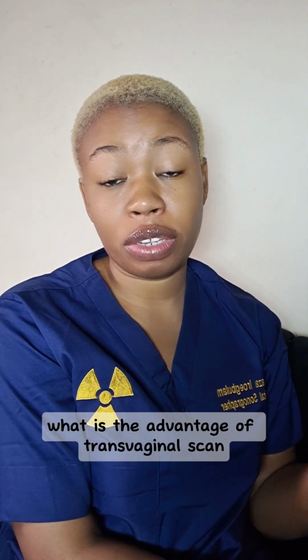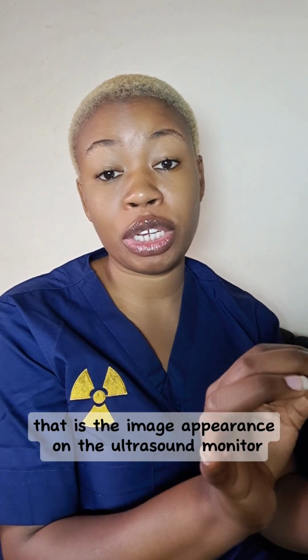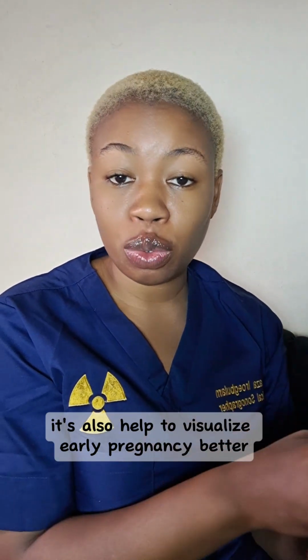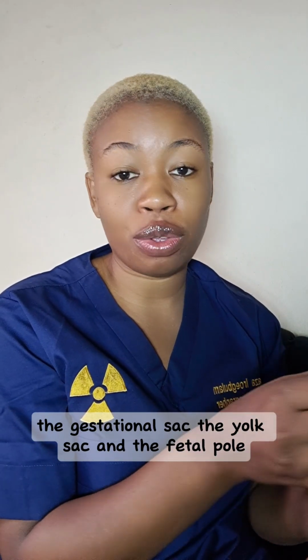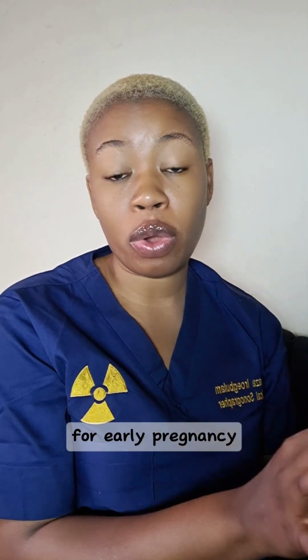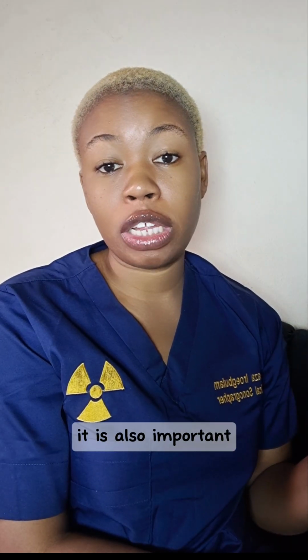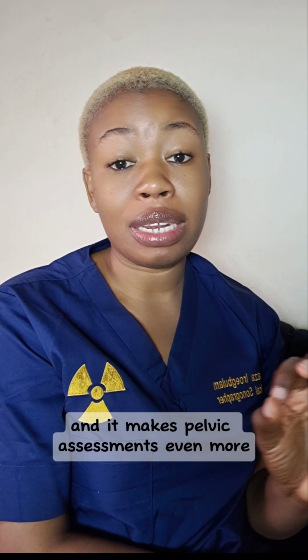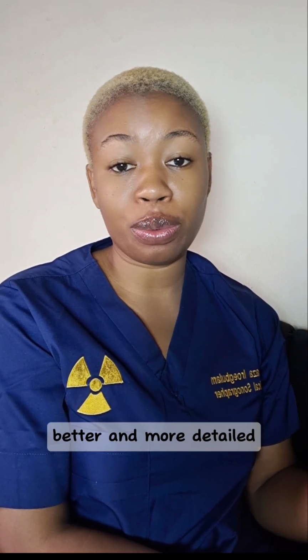What is the advantage of a transvaginal scan? Usually the image resolution is better. That is, the image appearance on the ultrasound monitor is clearer. It also helps to visualize early pregnancy better: the gestational sac, the yolk sac, and the fetal pole. For early pregnancy, a transvaginal scan is usually clearer. It is also important because of the close proximity to the pelvic organs and the uterus, and it makes pelvic assessments even better and more detailed.